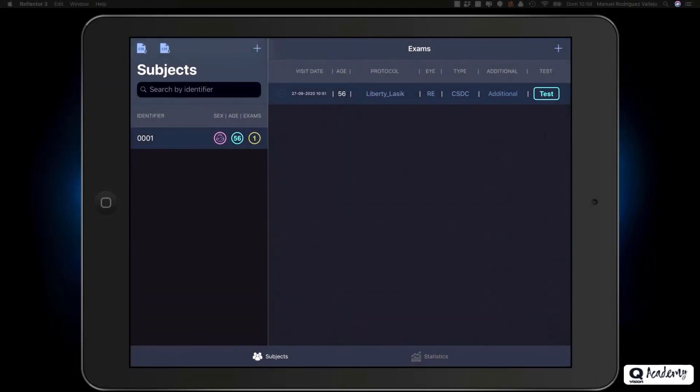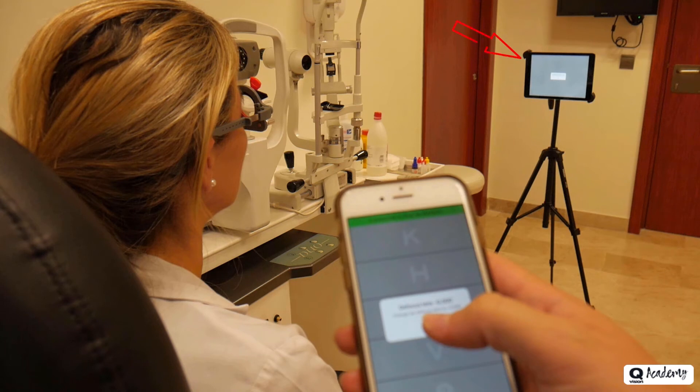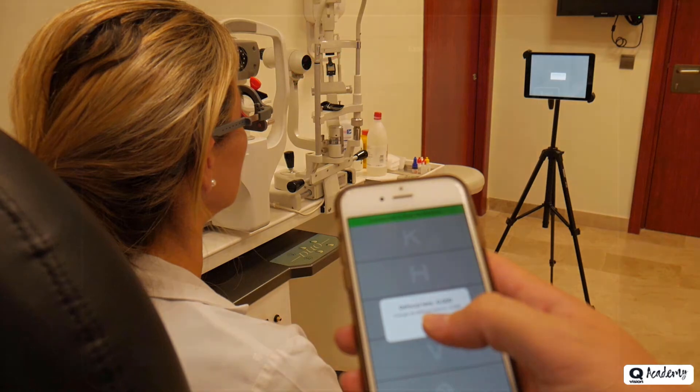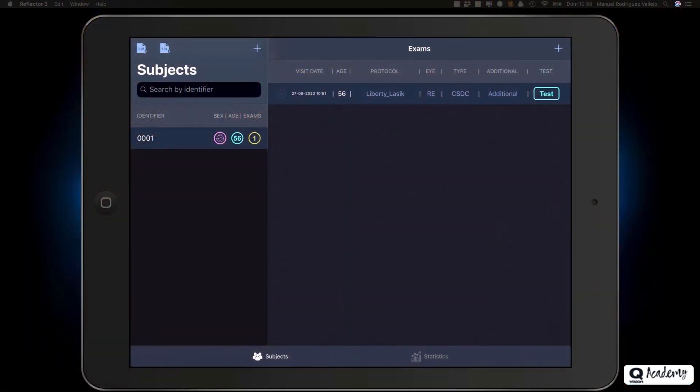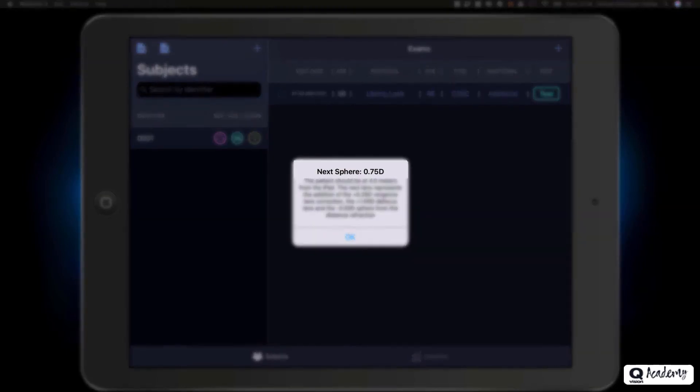We will have to select only the spherical component. So, the spherical component is minus 0.50, and we click on the save button. Before we start, the patient will be positioned 4 meters away from the iPad, because we have selected it in the protocol, avoiding any light source that could reflect on the screen. For this purpose, we can use a tripod with a slight inclination. The patient should be compensated on the test spectacle with a cylinder of minus 0.50 diopters at 90 degrees. Why don't we correct the sphere at this point? We are moving on to find the answer to this question.